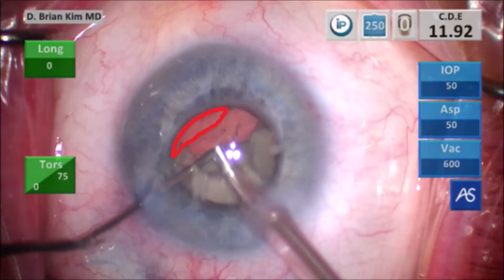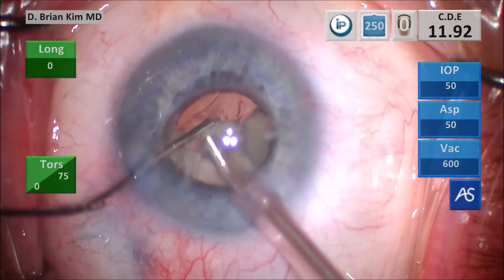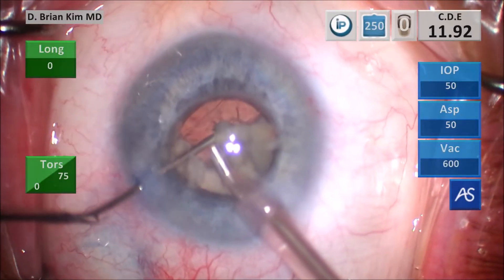Now you can see the defect more clearly — right there. As far as how it happened, obviously it's difficult to say. The chopper must have gotten it. The anterior capsule is intact. I'm pretty careful when I place the chopper out to the equator and I keep the bag inflated, so it's unusual for this to happen — very rare for me. But clearly something happened. The chopper was successfully placed underneath the rhexis edge, and it's possible the lens was tethered to the posterior capsule in that area, because that was the primary location of the chops being performed. It must have ruptured the posterior capsule.